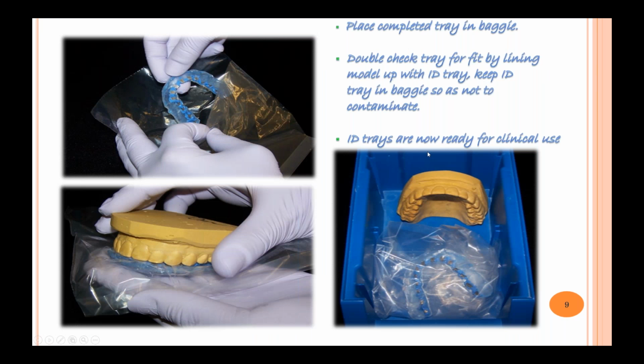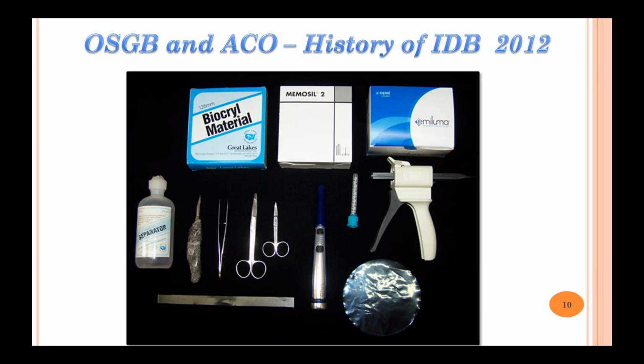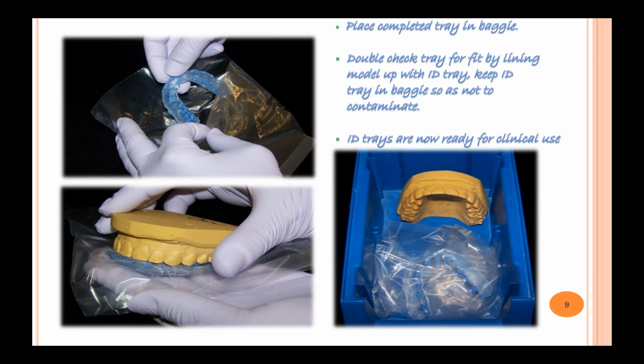And this here is, oops, I'm sorry, is actually what the tray looked like. And we would have our labs package it up and be ready to bring up to the clinic when the patients were there. But again, we could not light cure through these because of the light body PVS material, which was blue, not clear.